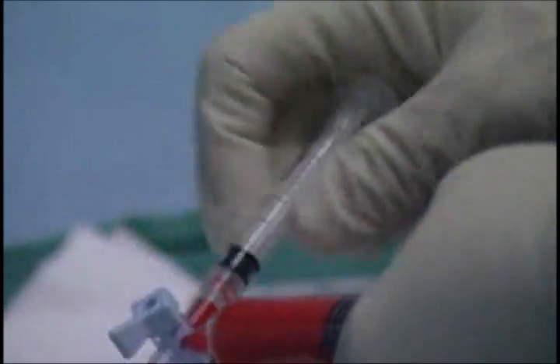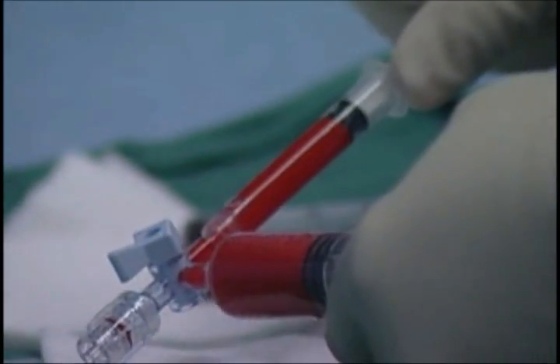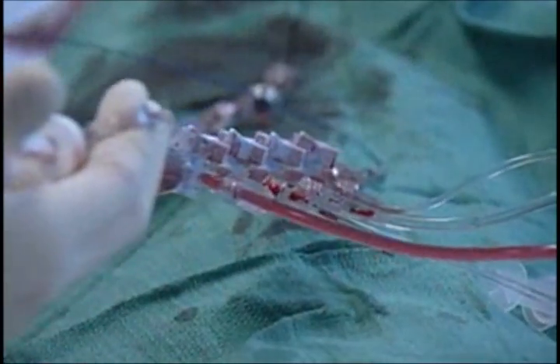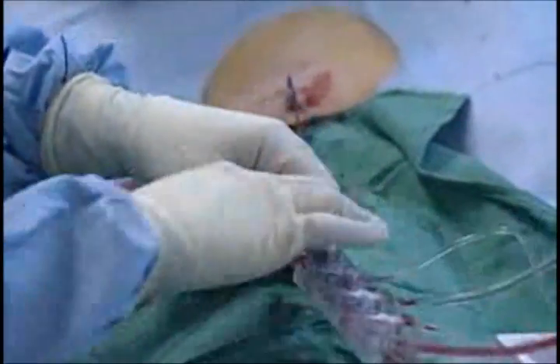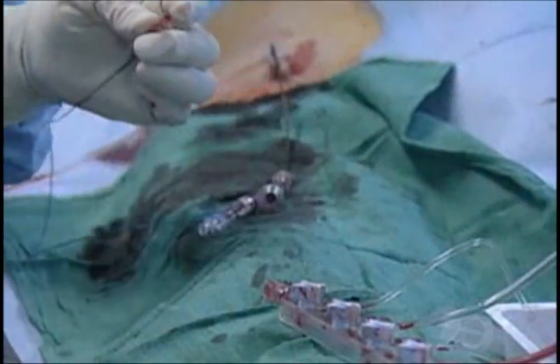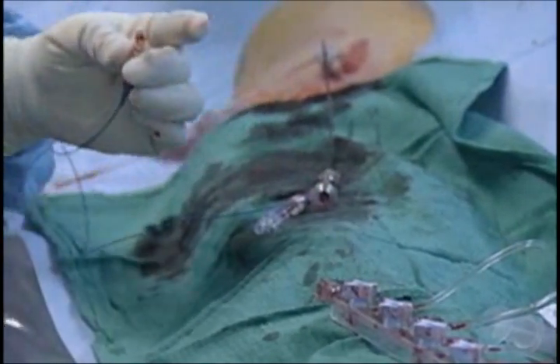So we load it into smaller syringes for administration through the microcatheter, which is what we're looking at here. The microcatheter is a three French catheter, which we don't always need to use, but when we're out in a small branch it is better tolerated than the five French catheter and allows us to go around more turns and bends.